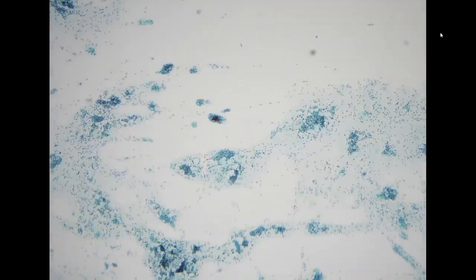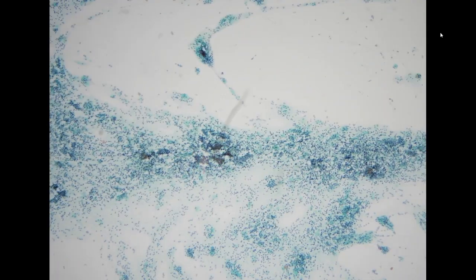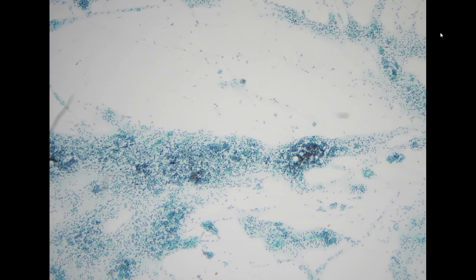However, the patient is already known to have a pelvic mass, so they need to investigate the cause. We signed it out as AGC, favor neoplasm, but it's indeed difficult to determine the origin of these atypical cells.